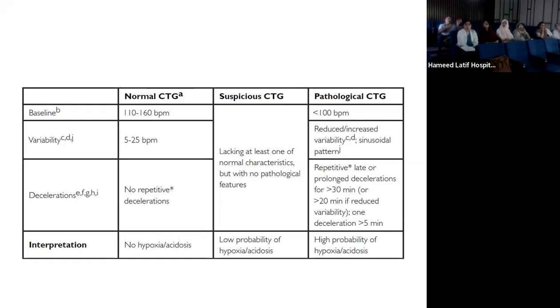So if she's 3 to 4 centimeters dilated, you will get this much of the baby's head. So like we do PS examination with Cusco's, it's like that. It's worse than that because the cylinder is quite long. So it's like this plastic cylinder which you put in, like a large tube, where your 2 fingers and your instrument go in with your hand.